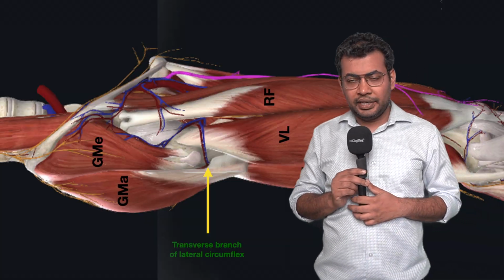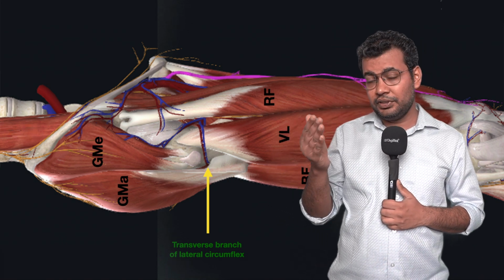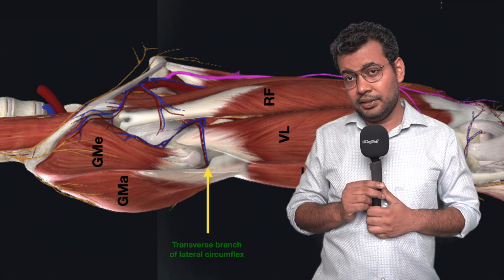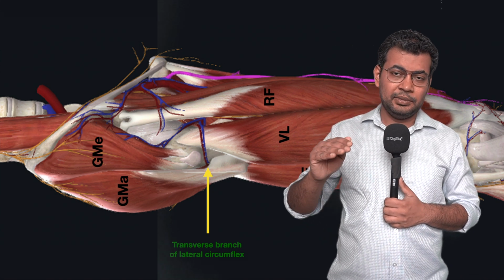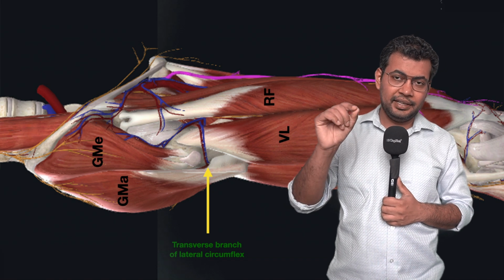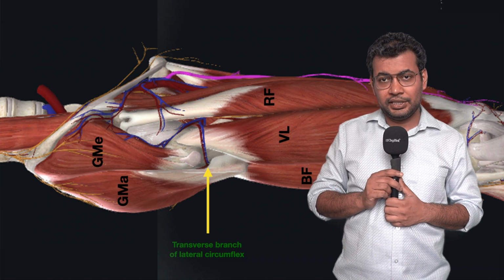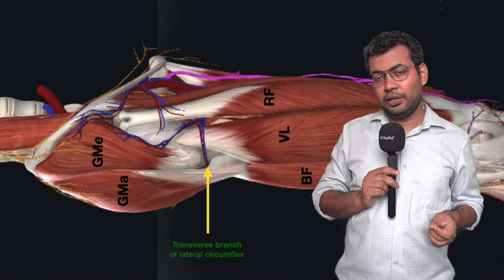Then we have the external rotators. We will cut the external rotators, keeping a margin of 1 centimeter from the bone. Then we have the gluteus maximus muscle. This is a sling of the gluteus maximus muscle which is attached on the femur, and there is a bleeder in the sling which may bleed profusely. So we have to be very slow during detachment of the gluteus maximus sleeve. We identify that bleeder, we coagulate or tie the bleeder, and then we cut the gluteus maximus sleeve.